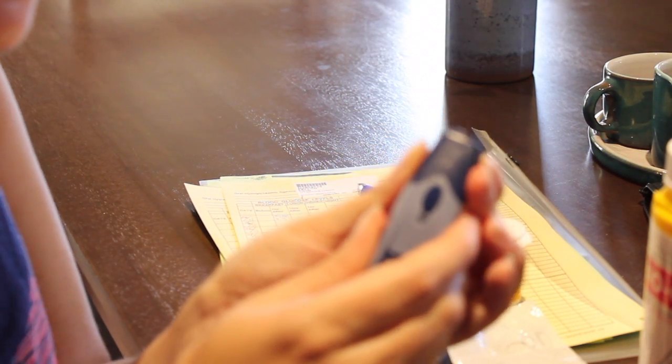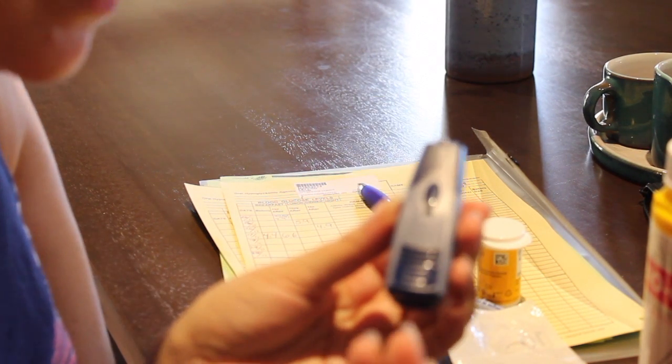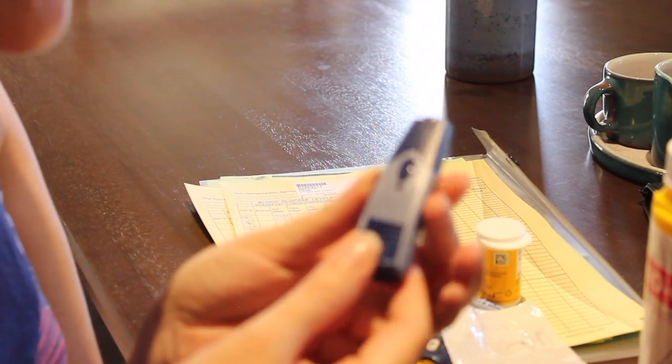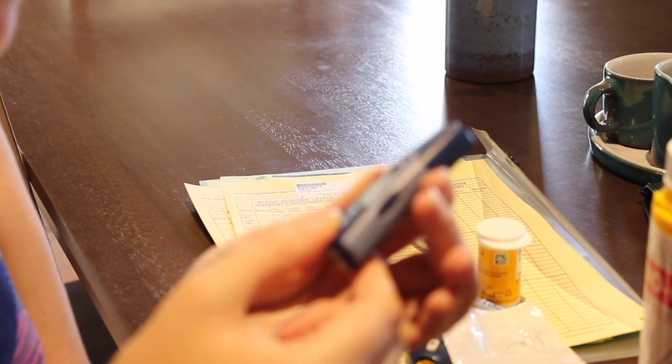Ready for pricking. Yes, so that is good to go. And when it's a new one, you have to twist the cap off. And then you put this lid back on here. Now, if you're using it multiple times that day, or you did not hear a click, what you need to do is pull this back, make sure it is loaded. Okay, it's already loaded, so you won't hear a click here.